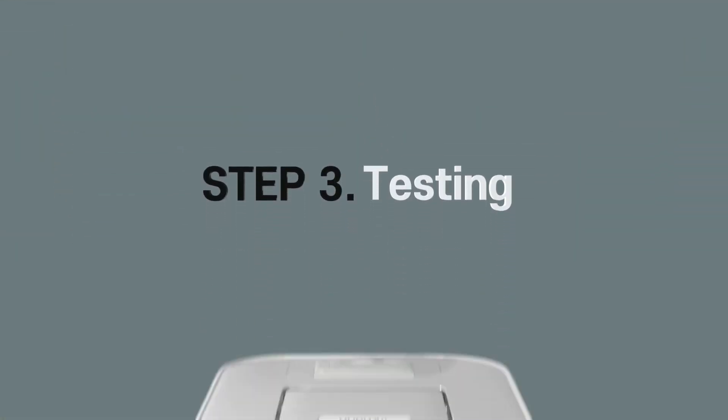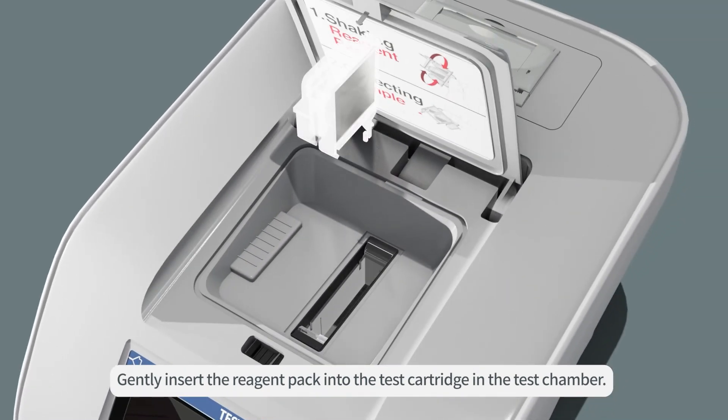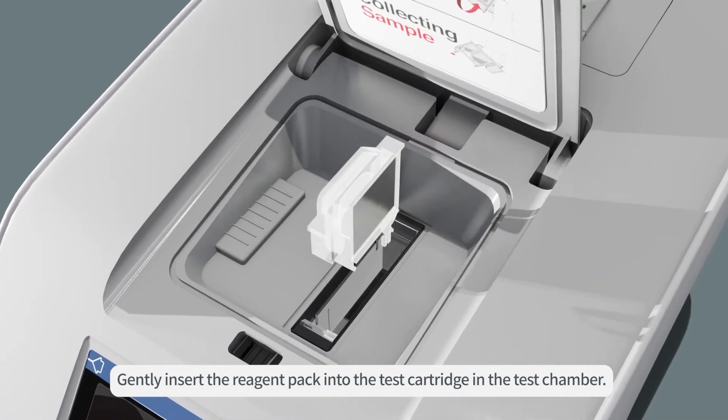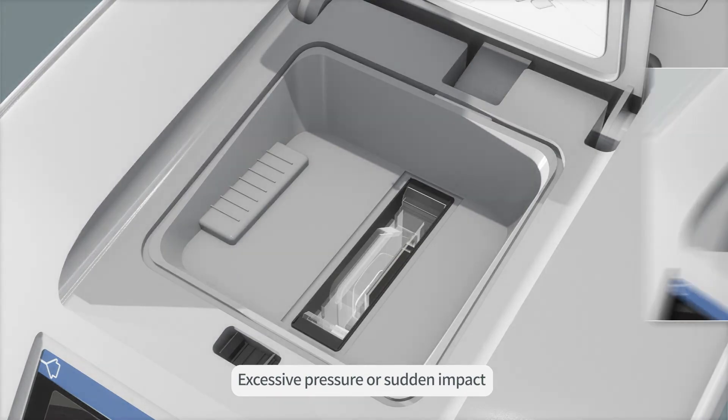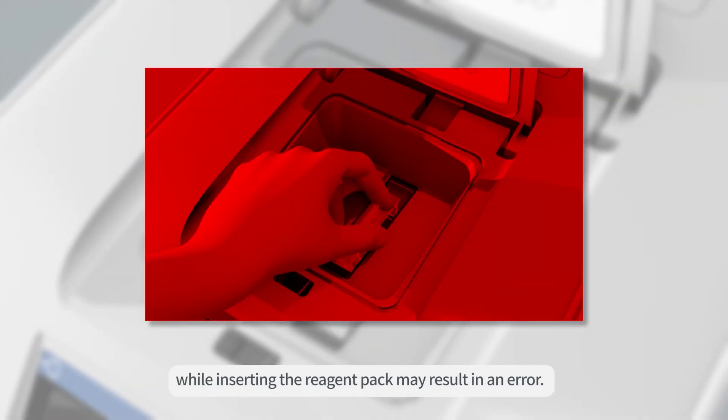Step 3. Testing. Gently insert the reagent pack into the test cartridge in the test chamber. Excessive pressure or sudden impact while inserting the reagent pack may result in an error.